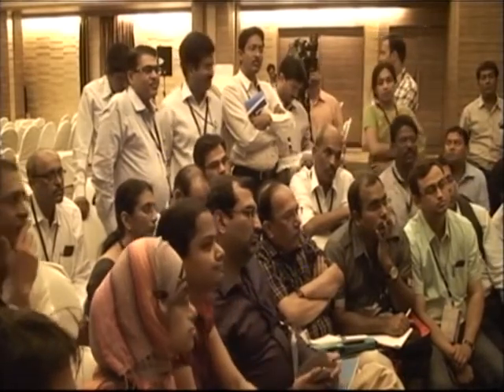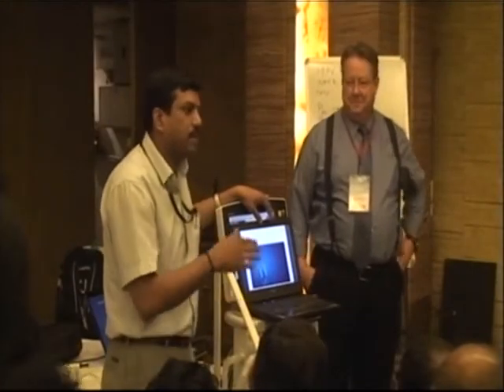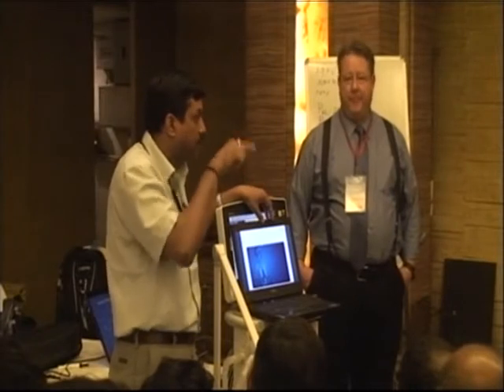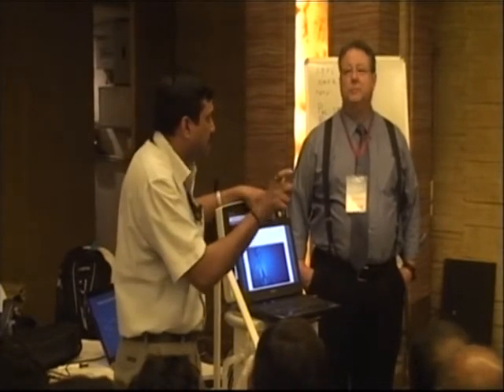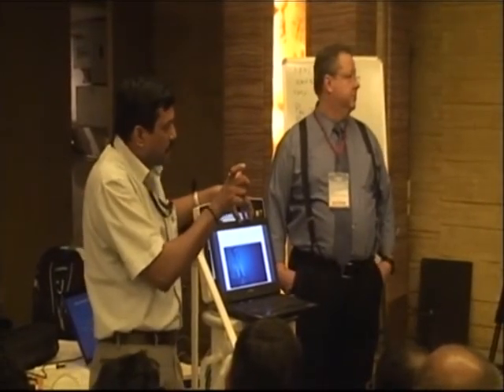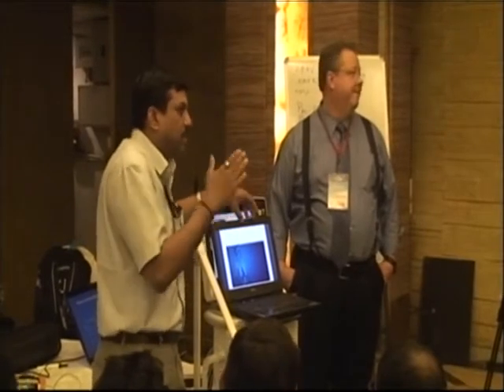And that's another one, you have to have the right machine. You can't just do it with everybody. Normally a ventilator works when the patient triggers the breath, the negative pressure is created, then the machine senses it, and then the machine delivers the breath. So there's a time delay, it's more than 100 milliseconds. So there can be a patient maybe fighting with the machine. If the patient wants to exhale, the machine is delivering a breath.